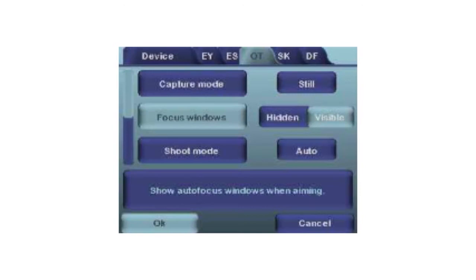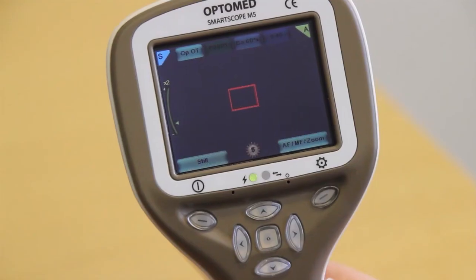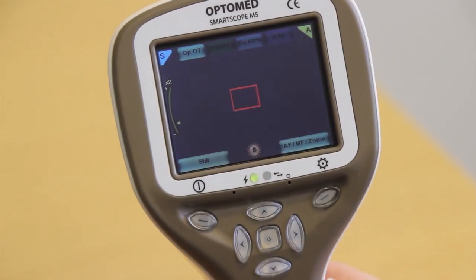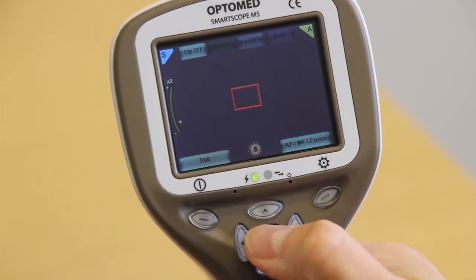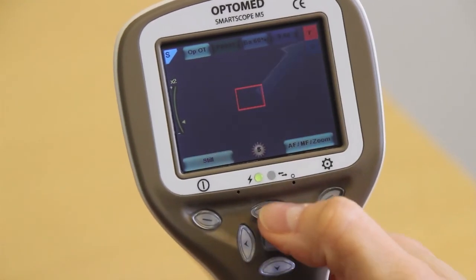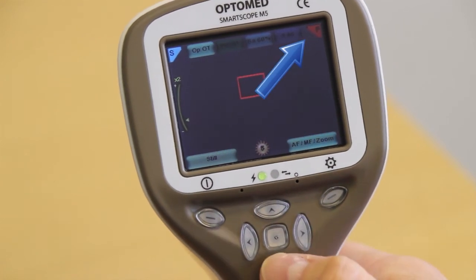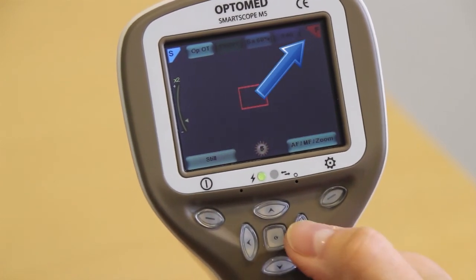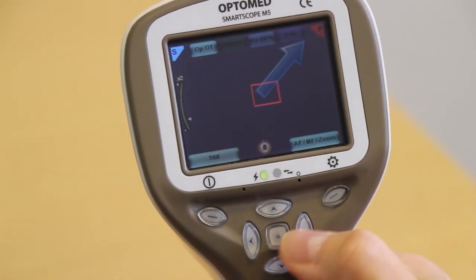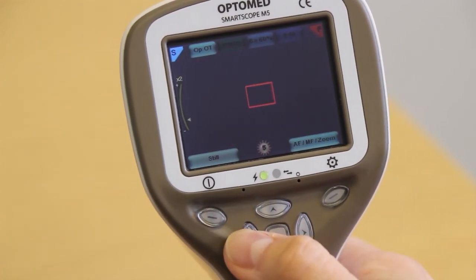Focus window: the focus window feature helps the user target the correct focus area in the image. You can hide or enable the focus window in the OT menu. The focus window is activated by pressing the middle key until the icon F appears in the screen. Move the red focus box by using the arrow keys.